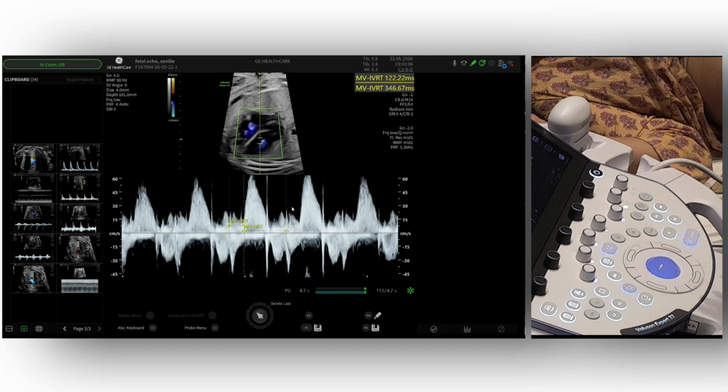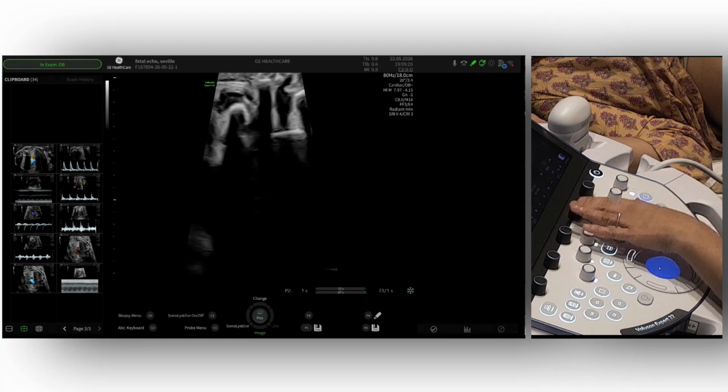So the normal thing is like this, yeah? So it takes more time from the ventricle to the atria, not the other way around. And then in some types of tachyarrhythmias, it will be very important to know these time periods in order to go to the differential diagnosis. So just having at the same time the atria and the ventricle will allow us to see if for each atrial contraction there is one, or if it's 2 to 1, or if it's irregular or whatever, and then also to measure these time intervals.